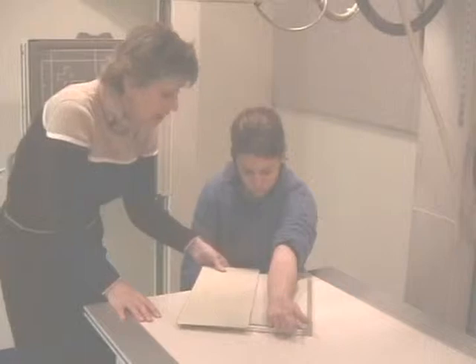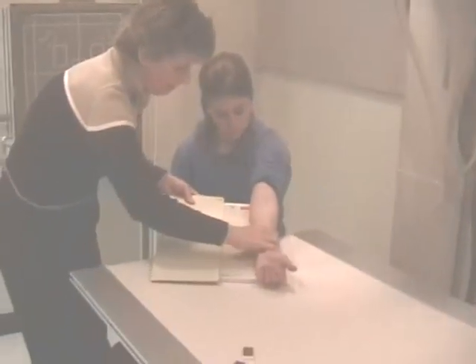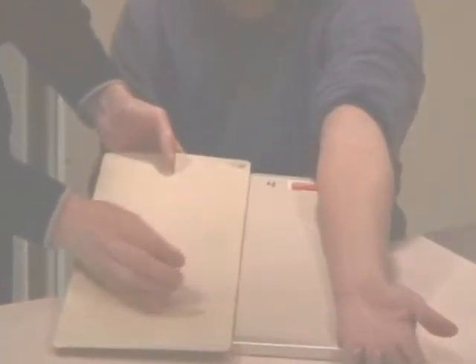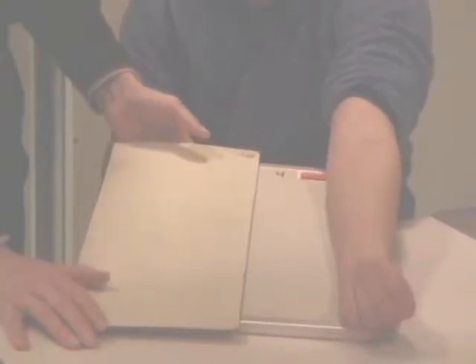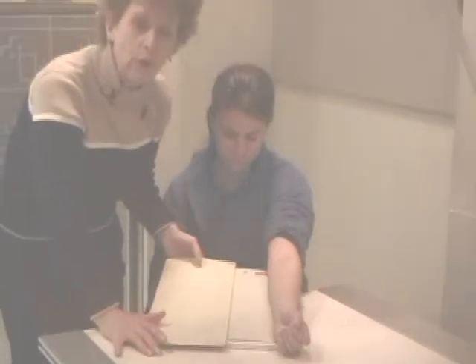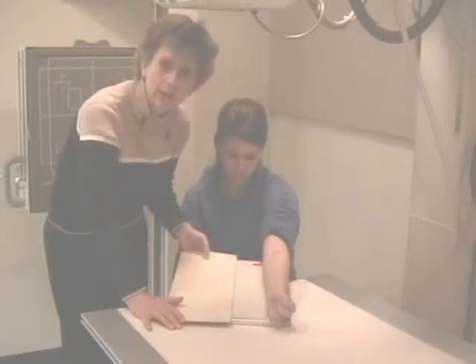I'm going to analyze the ID blocker. We're just going to kind of lift this up here so you can see. Drea's arm is going to come out here. I want you to look. The part film reference point is the joint of interest should be included 1 inch from film's edge. Well, in this lesson, it's going to be the carpal bone should be 1 inch from film's edge. But if I have a short forearm, you have to include both joints on any forearm. But if it's a short forearm, we're actually going to center that forearm, maybe go off of our PFR a little bit. So we're analyzing our patient's shape right now and her size.